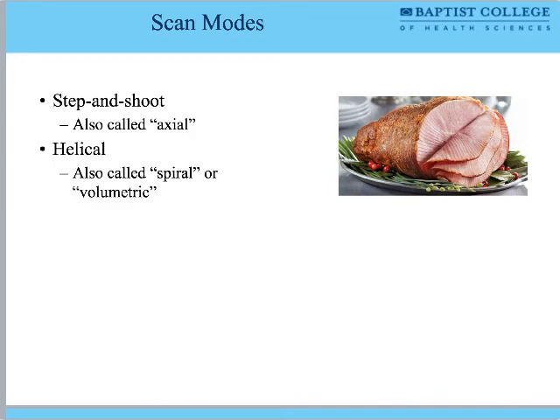Where we start to worry a little bit is if it's not in the raw data, we cannot represent it, right? So if the slice was too thick and we did not see the raisin in the raw data, no amount of messing with that raw data is going to produce the raisin. We needed to have a better protocol to start with, right? But yeah, short answer, yes, it's primarily with the image data.